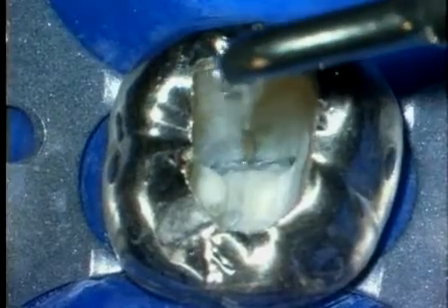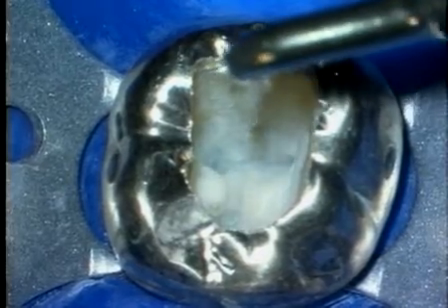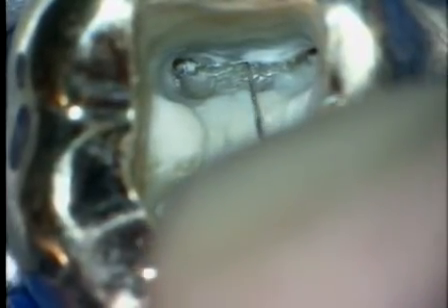Notice how we have unobstructed vision into the mesial aspect of the pulp chamber. We're not looking at the back end of a bulky handpiece. Use this in a painting brush-like motion. Here we've uncovered an extra orifice between the MB and the ML orifices. When the tip of the file engages, we get handle flutter.